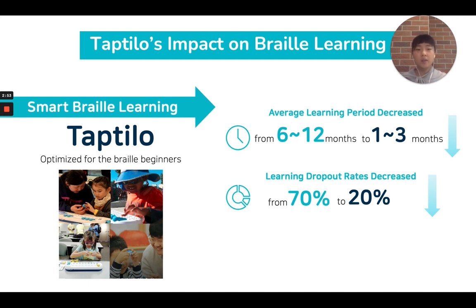Also, we've done a project in Korea. We called it Sesang File. With Taptilo, the blind students learn Braille for 16 weeks, and about 80% of students master Braille only with Taptilo within 16 weeks.